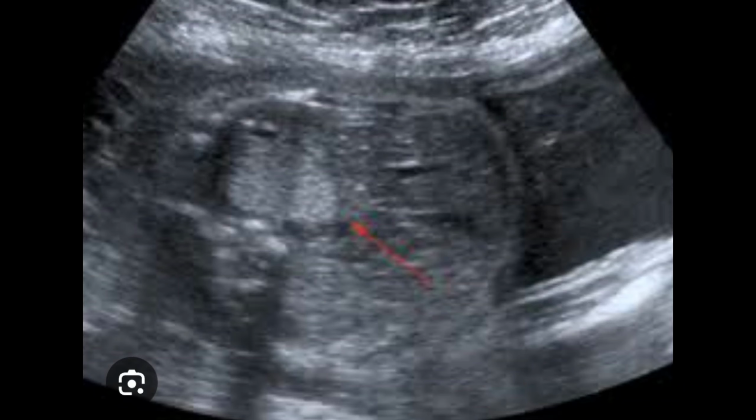Here is another example of the fetal neuroblastoma. Always pay attention to all the fetal organs: liver, spleen, kidneys, heart. These are very important areas, because when there is hydrops you can see the fluid. When there is ascites, then there is pleural effusion, you can clearly see. So as far as this scan is concerned, you can see that the fetal kidney is occupied by the neuroblastoma, which is clearly visible on this image.